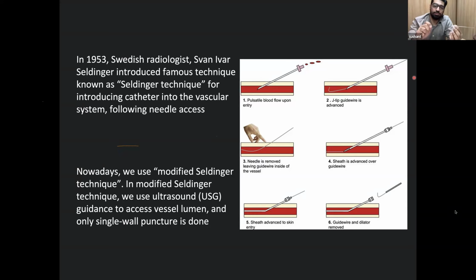So this is the basic wire. This wire can be inserted through this needle. And once we insert this wire through the needle, now we have access to the cavity. Now this needle is removed, and we can use this wire as a guide way to introduce our catheter, dilator, or anything we have. It acts as a guiding measure and we can advance our other materials or catheters over the wire. So this makes the basis of the drainage procedure.